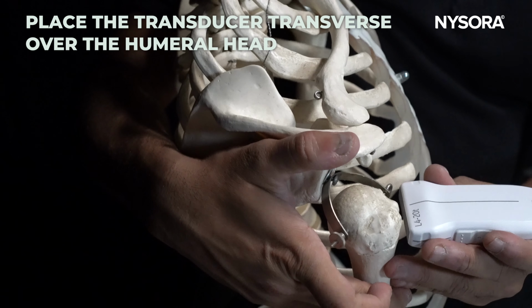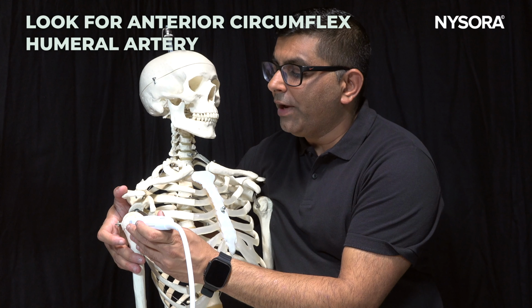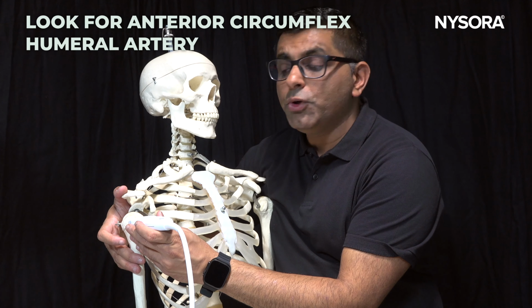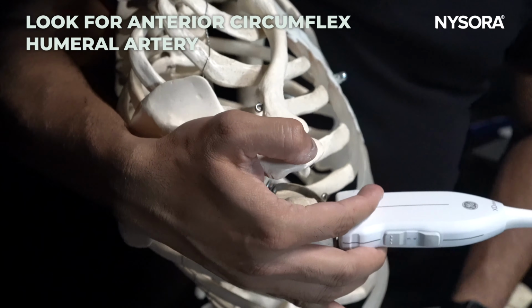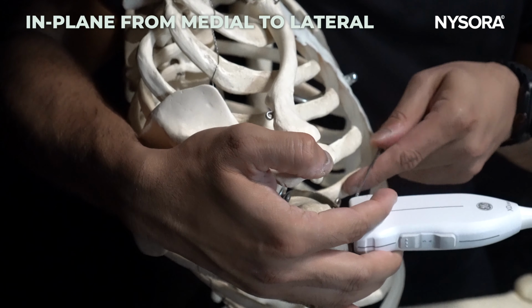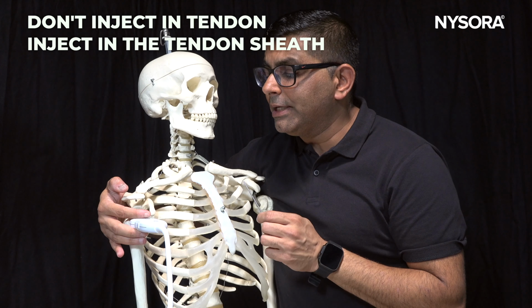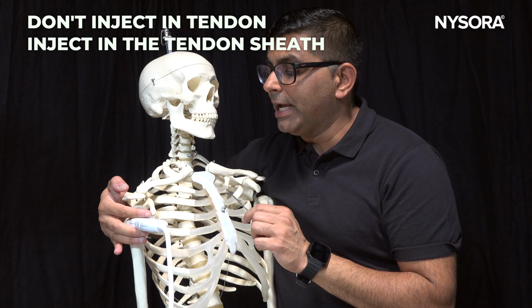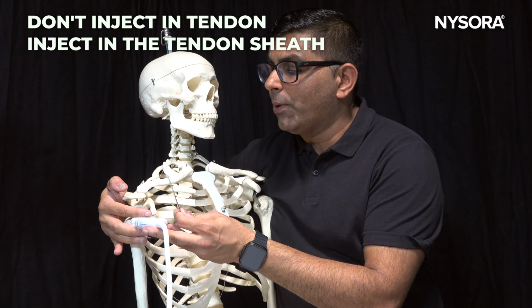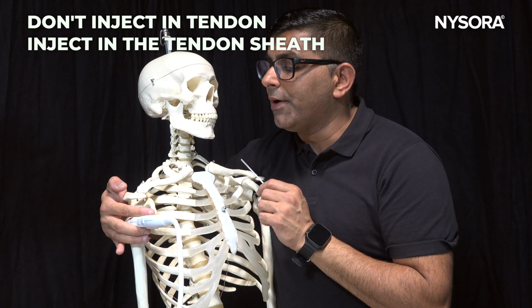The clinical pearl here: always put a color Doppler on, looking for an artery, which is the anterior circumflex humeral artery branch. The artery is usually placed laterally, so to perform the injection, I prefer doing it in plane, coming from medial to lateral, and don't inject the local anesthetic and steroid in the tendon. It's basically for the tendon sheath rather than the tendon. Injecting the local anesthetic and steroid in the tendon will lead to the rupture of the tendon, so only inject it around the tendon.